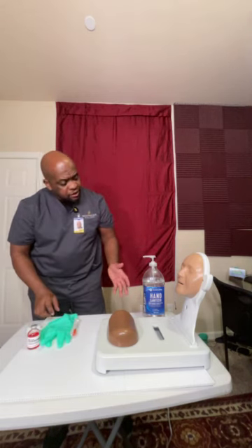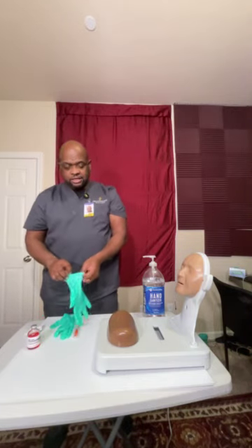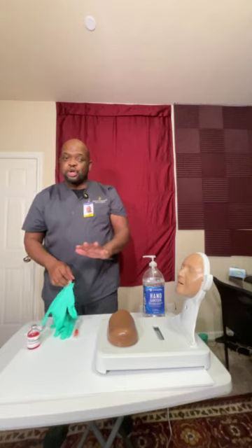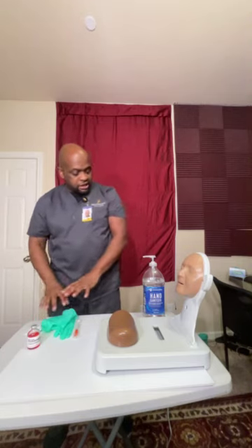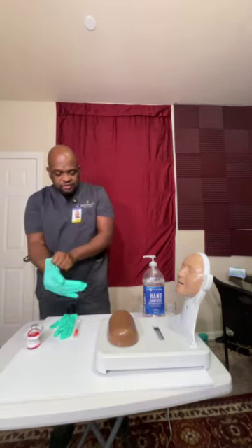Do you have any questions at all about the medication that you're going to be receiving? Okay, Mr. Jones confirmed that he has no questions at all about this medication. Mr. Jones confirmed he has no allergies. So before I even put on my gloves, I'm going to go ahead and do hand hygiene again. Clean my hands. Hands are clean. Okay. All right. Now I can put on the gloves, and I'll go ahead and prep the medication in the meantime. So gloves are on.